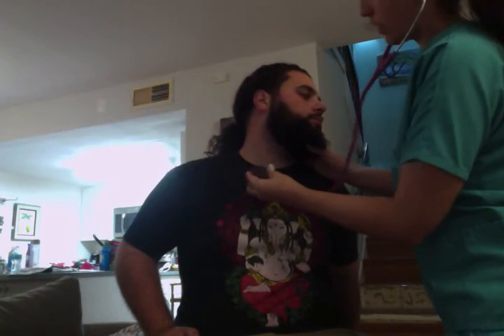We're going to use the bell of the stethoscope. We'll have the patient turn their head to one side and inhale and exhale and hold it. And at that time we can listen. No, just hold the exhale. And turn your head. And inhale and hold the exhale. And there is no bruit noted.